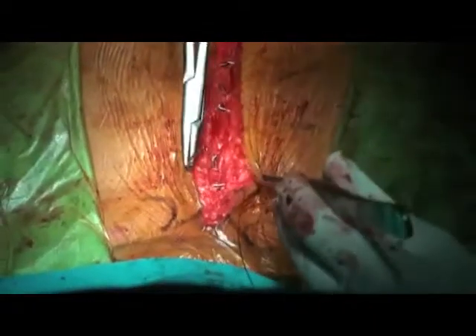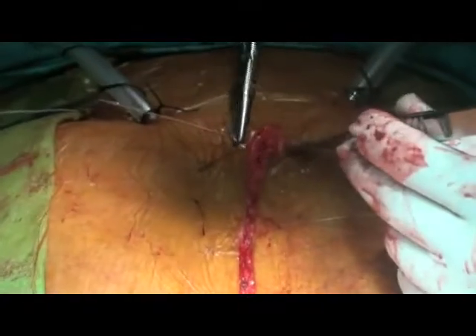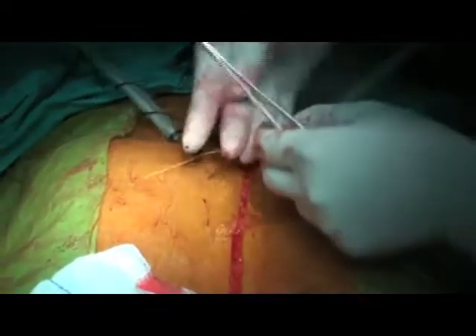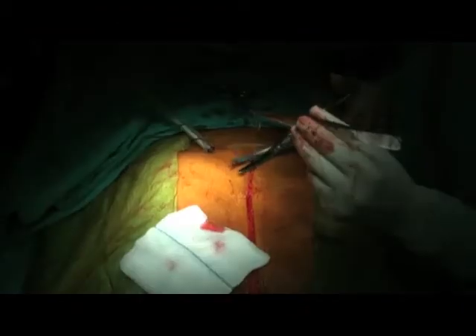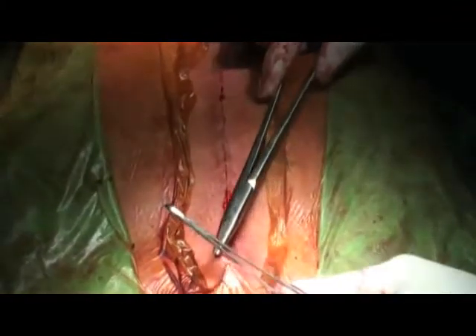After doing this layer, simply put the subcuticular stitches. Always try to bury the last point underneath the skin so that the stitch never needs to be taken out. Thank you very much for watching this video. I hope this will be helpful for MCh and DNB students joining cardiothoracic surgery — after seeing this they will be much more confident of performing a sternotomy soon after joining, maybe after a few weeks, which normally they don't get even after six months of departmental exposure. Thank you very much.